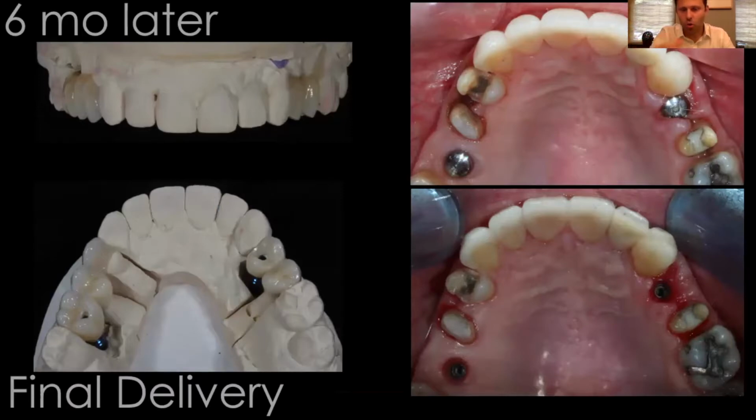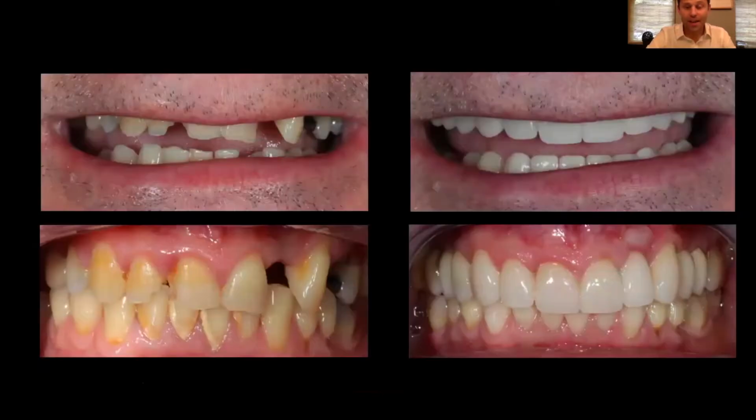Really got rid of an old amalgam filling, and then you make a veneer onlay on top. On the opposite side is a screw retained implant crown, and then a single unit implant crown as well. So this case literally has every kind of restoration, from inlay veneers to regular veneers to crowns to screw retained implant crowns to traditional. It has everything.